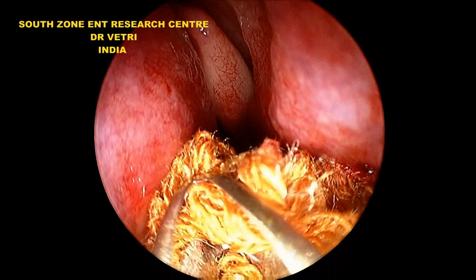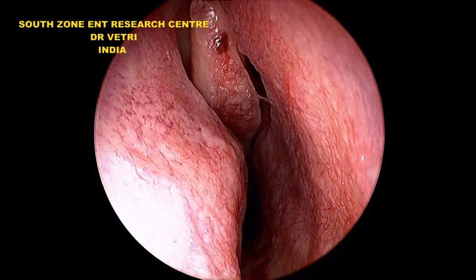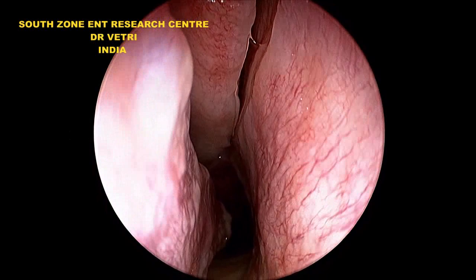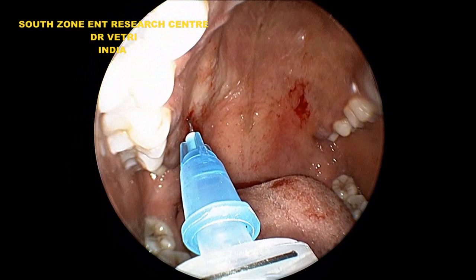The nasal cavity is packed with betadine gauze and it is removed in the evening. The same procedure is now continued on the right side. The inferior turbinate is now shrunken because of the decongestant effect of xylocaine with adrenaline, and you can see beautifully the greater palatine block.